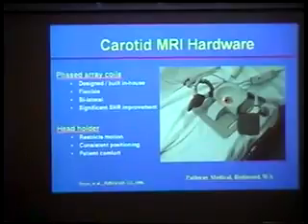We also have a pretty nice head holder design, and this is an older model of the head holder we have. The idea is that you place the patient's head there such that they can't move easily. In order to get good images from patients, one thing that is really critical is that the patient remains pretty much still over all this time. As I mentioned, MR tends to be fairly slow. If you have a protocol that requires patients to stay there for not only minutes, but up to an hour, you have to have some mechanisms to control their motion. This head holder is one of the mechanisms, and it turns out to be very useful for us.